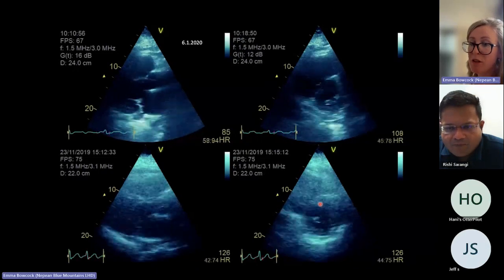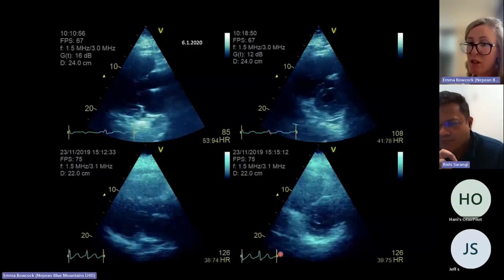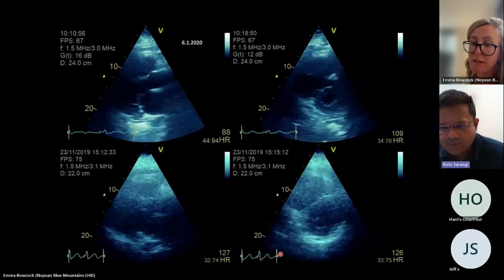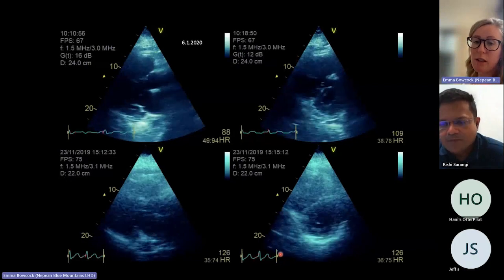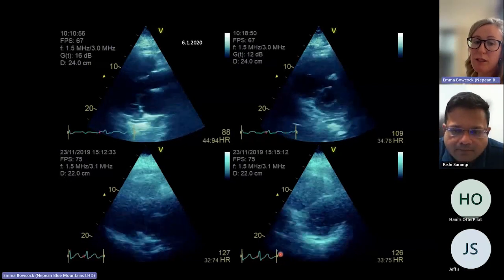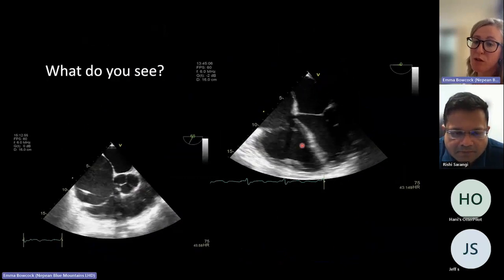That's classic paradoxical septal motion. You're just seeing that dip just at the end, very transient at end systole. It can be missed if you don't train your eye to it. So the filling features for acute cor pulmonale, but difficult to tell. So we did a transoesophageal echo, and this is beautiful, hey?